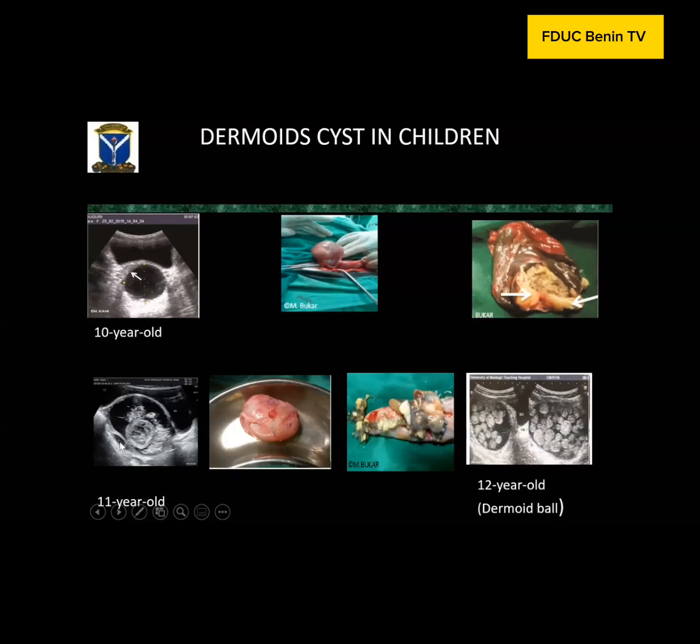Somewhere here you can see follicles, you can see ovarian tissue here, and you can see a halo between this follicle and the cyst. This suggests that this cyst will be easy to tease out at surgery, and of course it was easy to tease out at surgery. And look at the content at surgery. Look at here, the fat, the cartilage. This is a rare appearance actually of dermoid, having these lipid materials dispersed within the cyst. This is the first case I've seen so far.